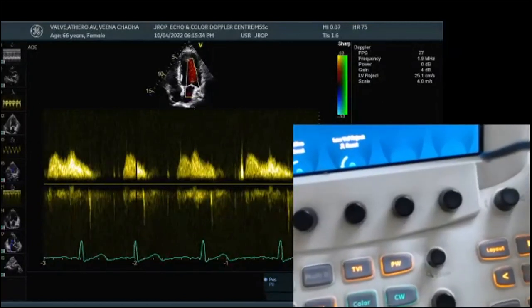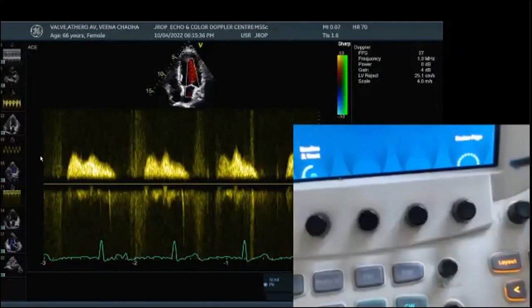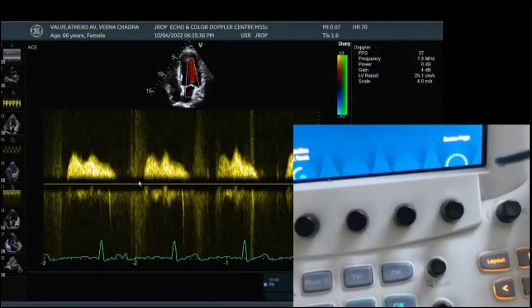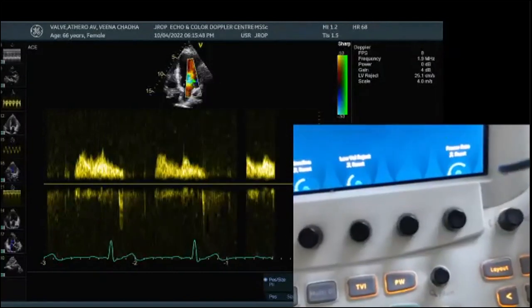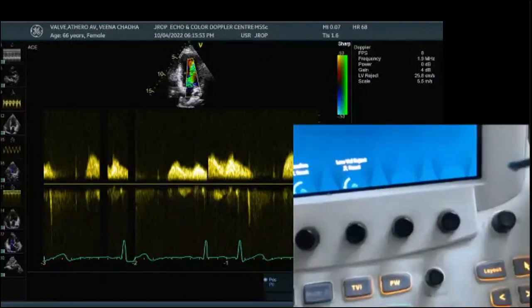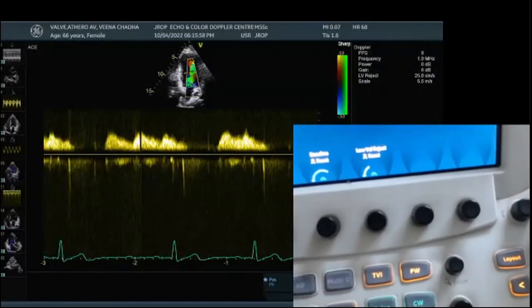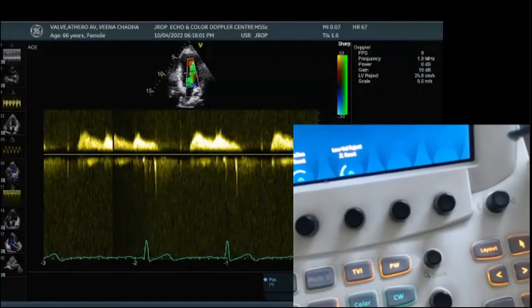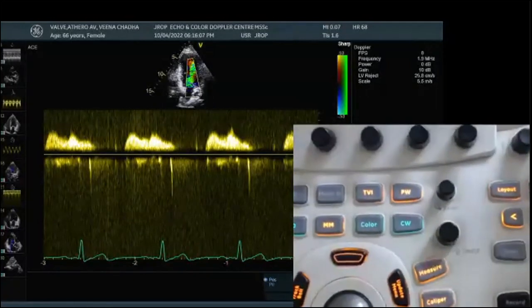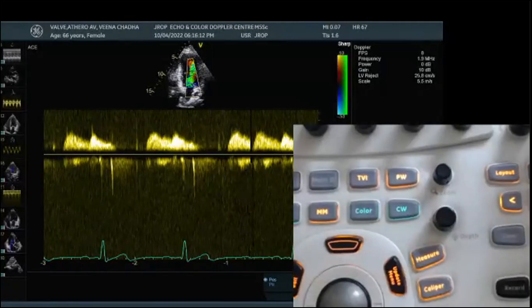Even in this, if you happen to look, what exactly is happening? Look, this MR jet is having aliasing now. This is the MR jet, correct? So what do I do now? I'm going to increase my scale further because continuous wave Doppler has a very high scale. So I can contain my MR jet Doppler spectrum. So that's how I do it. Change the baseline, change the scale, switch over to continuous wave Doppler, and change the scale again. Four things. Got it, sir.